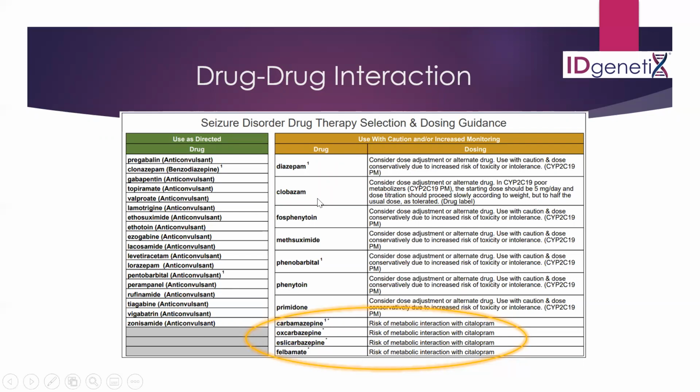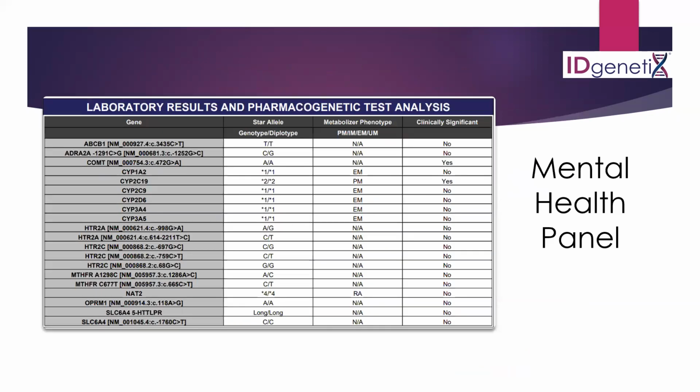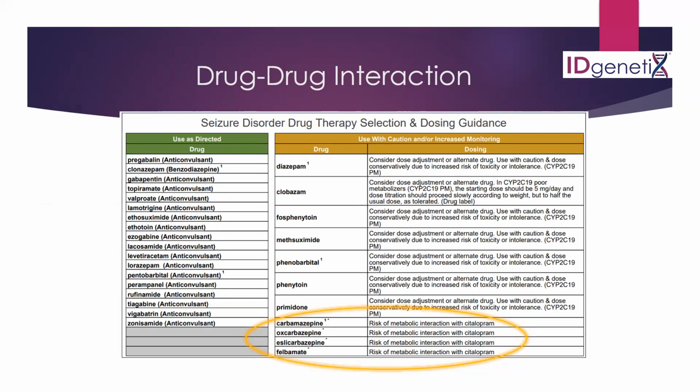And also, if you see there's little number ones on some of these medications, that just means those medications are on Beers criteria. Basically, a list of inappropriate medications for patients age over 65, either due to anticholinergic effects or risk for falls. And so it does give you a detailed explanation on that piece and lets you again decide what that looks like for the patient.